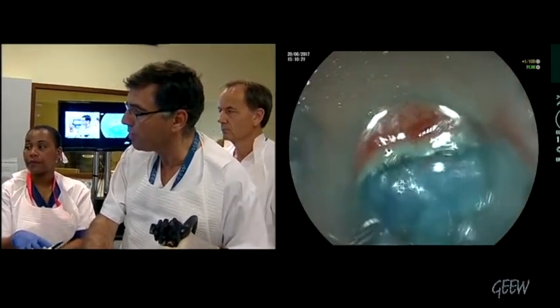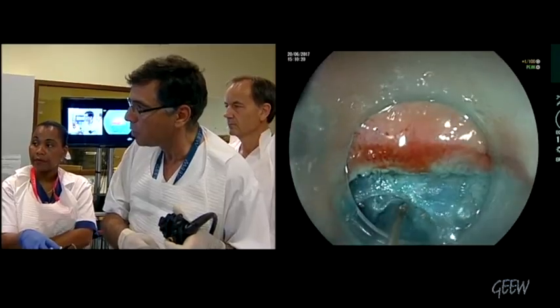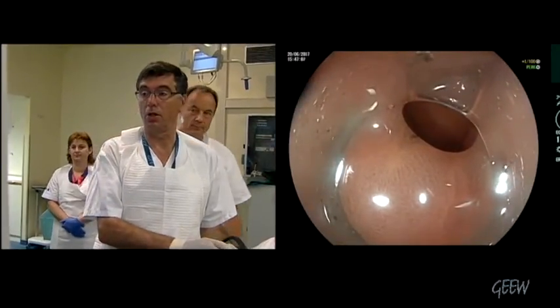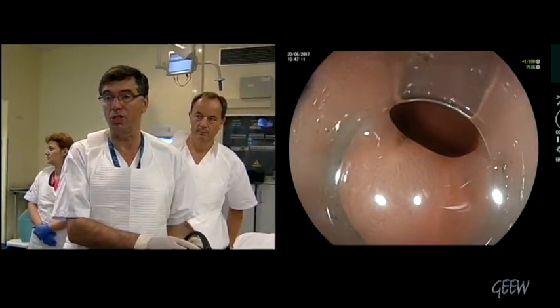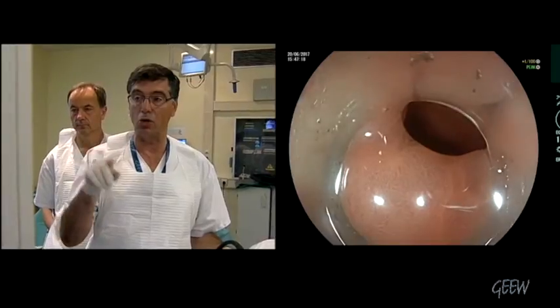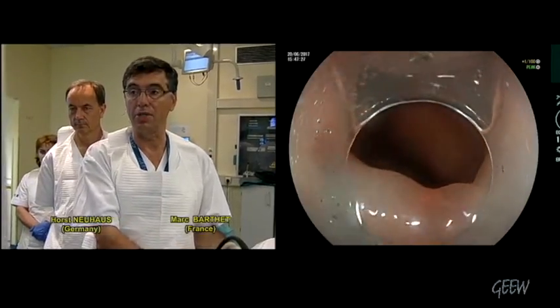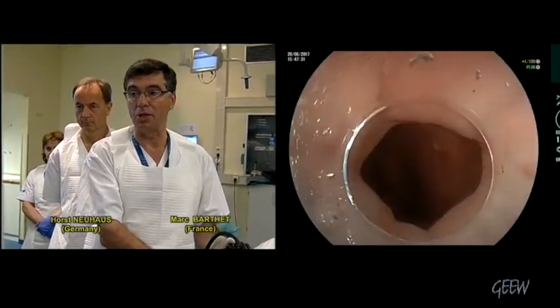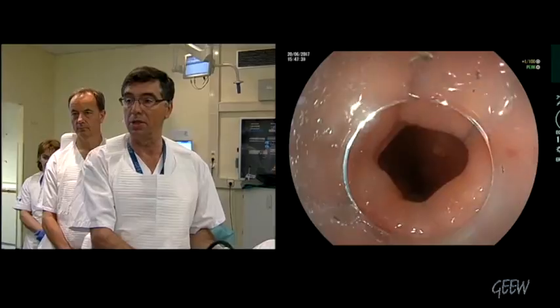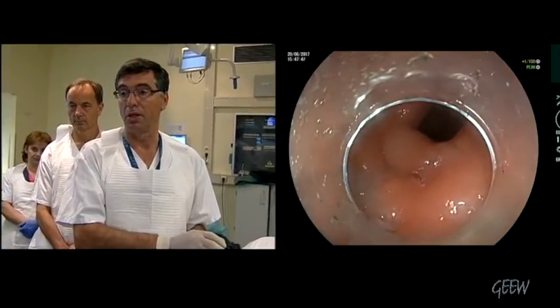I try to go very cautiously because I don't want any perforation. We finally found the pyloric arch, which is not so thick. We check the position to the gastric lumen every time. You can see at 6 o'clock the elevated tunnel, because we reached the pylorus. Interestingly, we have no more pyloric spasm, even though we did only submucosal dissection and have not yet done the myotomy. I observed this in many patients and cannot understand why.